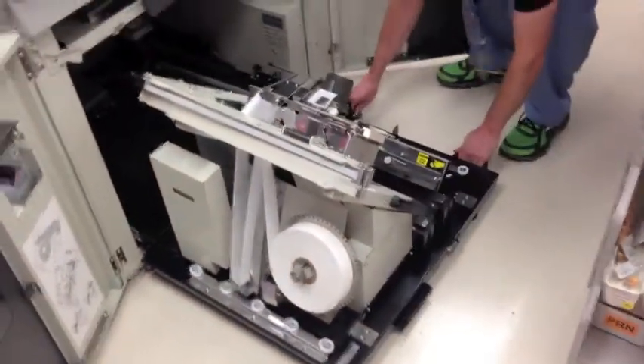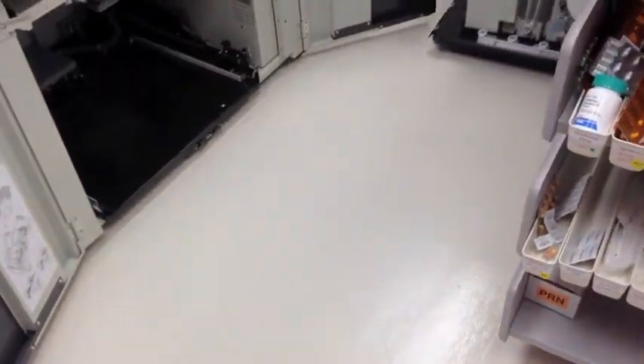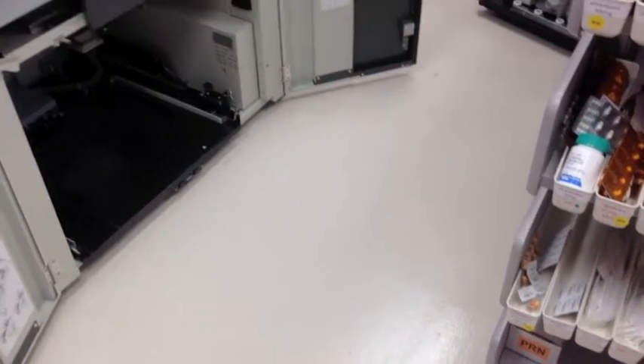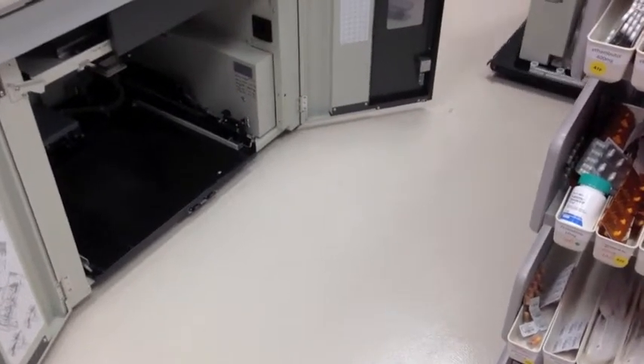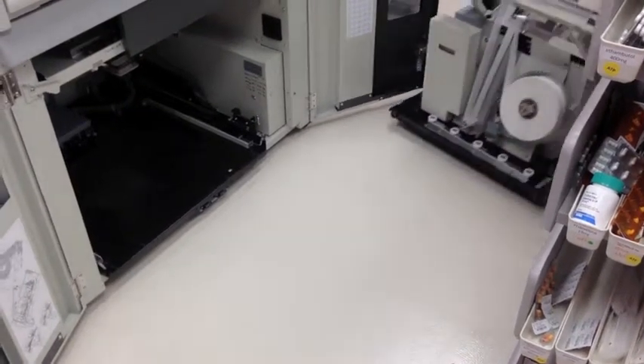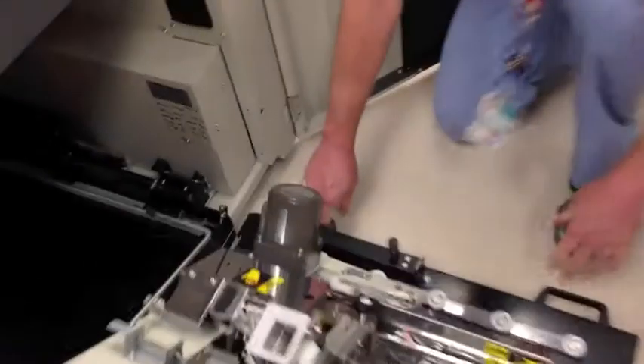You can now wheel away the broken LPU. Children's Hospital keeps a replacement LPU. Wheel it in and line it up at the front of the machine, pushing the line-up guide forward.